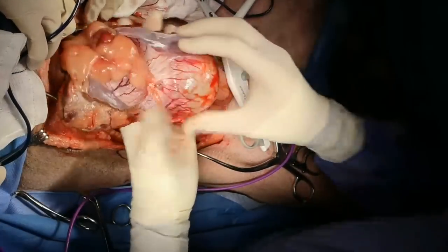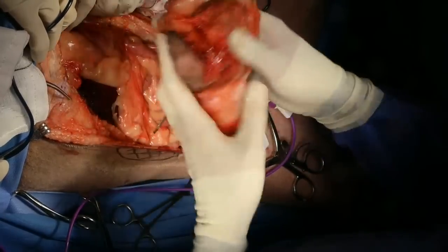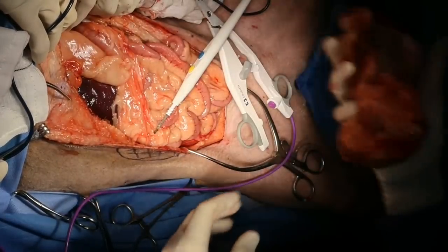All right, so that's our deep margin there. That's peritoneum covering it, so that's great. So I'm very, very confident that we've gotten this whole thing out here.